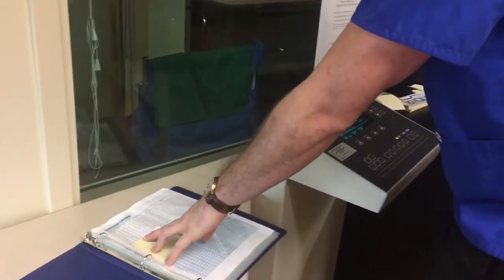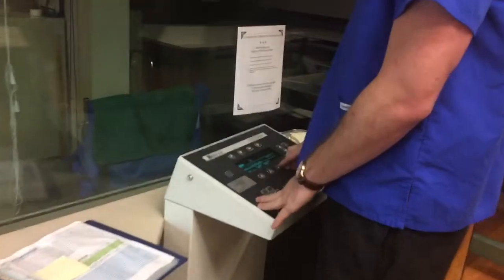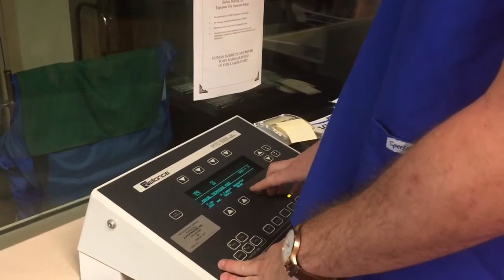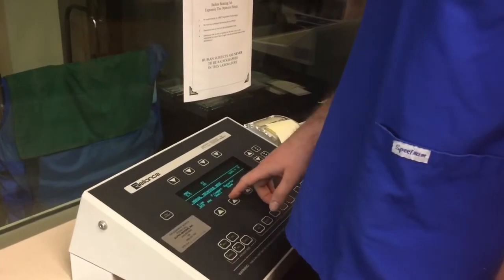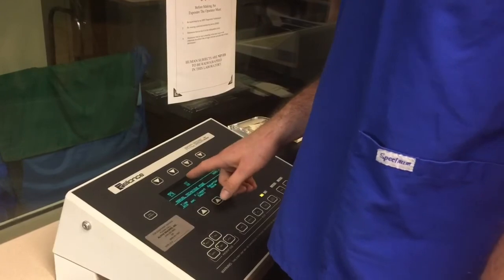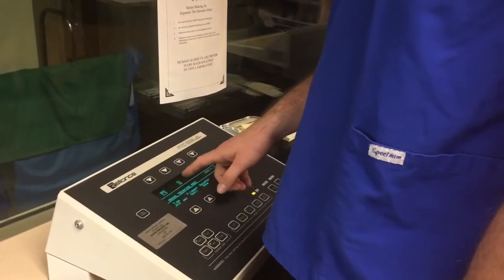It's 68 kVp at 3 mAs with a small focal spot. So I set the receptor to none because we're using tabletop. The filament is small for bony detail, and it's at 3.5 because we can't get to 3, so we have to go up, and 68. And I would just inform the patient to hold still, and then I would take the exposure.